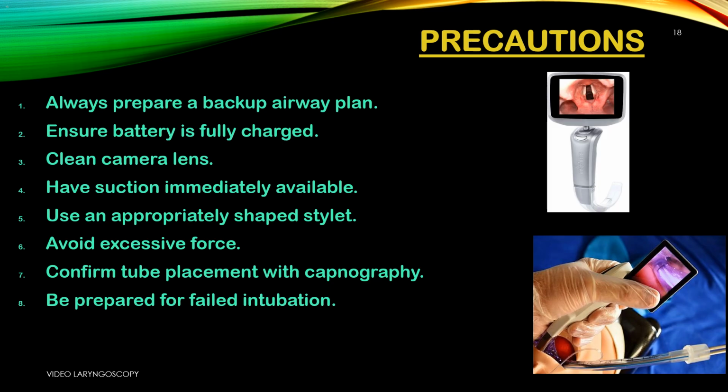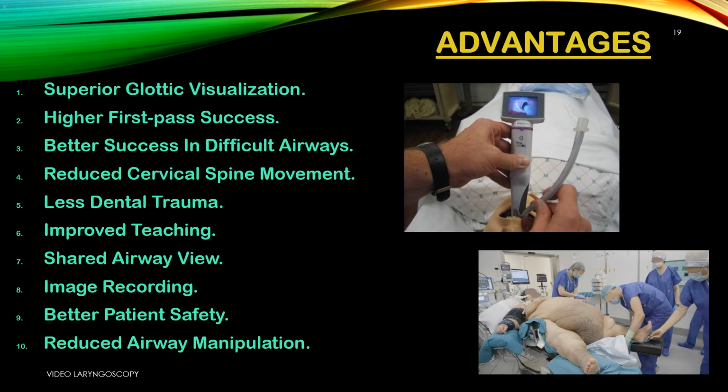8. Be prepared for failed intubation. Stay calm and switch to backup plan fast. Every second of hypoxia increases risk to the patient. Advantages. 1. Superior glottic visualization. The camera gives a wide, magnified view of the vocal cords. Easier to see even with poor anatomy.